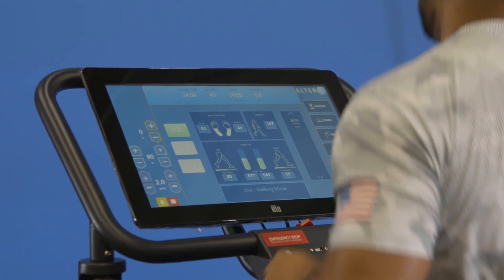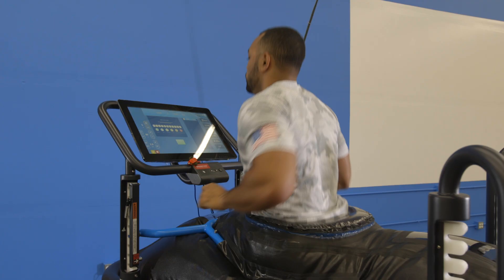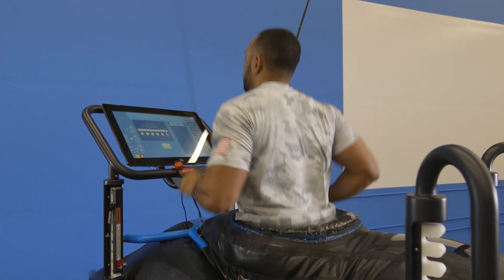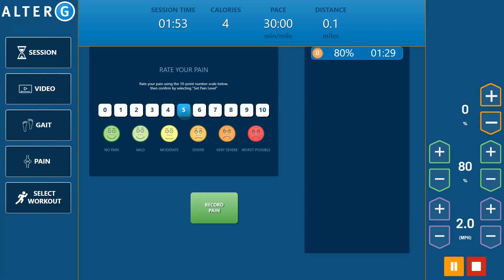The unique pain recording feature helps establish optimal parameters for training and tracking progress by correlating gait and unweighting percentages with athlete-reported pain scores. Because pain tolerance is different for everyone and varies by rehab stage, the pain recording feature helps you determine each athlete's load tolerance at various body weights and speeds.